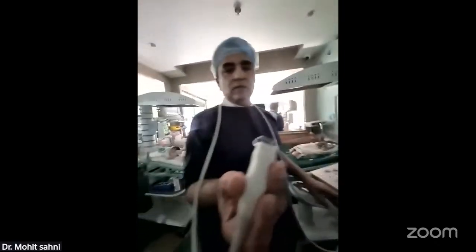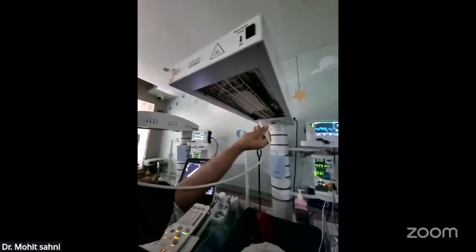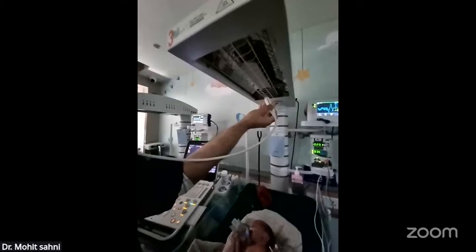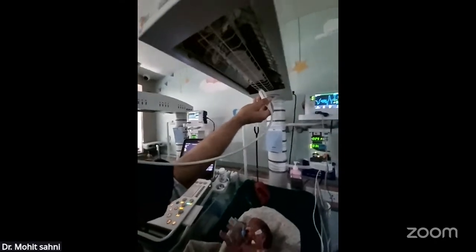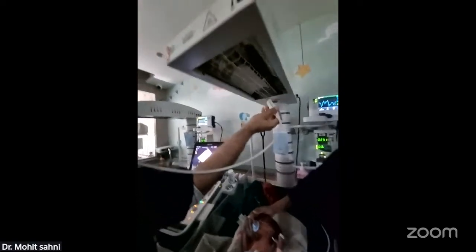We put the gel. I'm just warming the gel. The various settings on the machine have already been preset as per the head ultrasound settings.